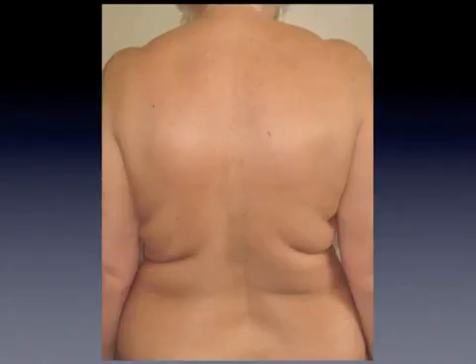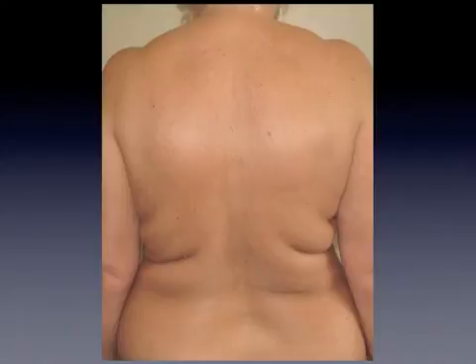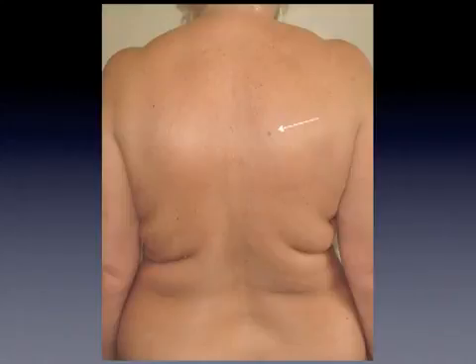If we look more carefully at the back of this 70-year-old woman, we can still see a nevus indicated by the arrow. These nevi in the elderly are usually easily recognized clinically as dermal nevi. Dermal nevi upon dermoscopy typically show a papillomatous surface with some vessels within the papilla and residual brown coloration.